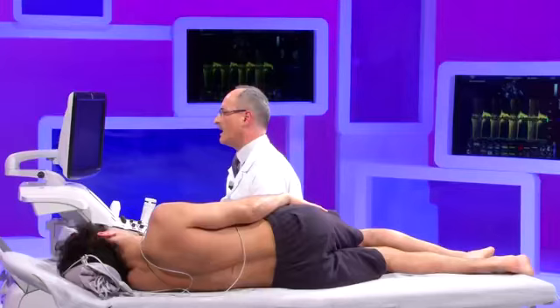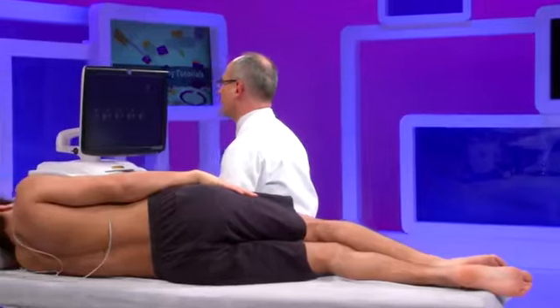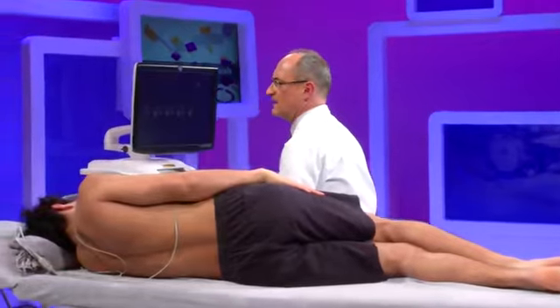Then it may be useful, particularly in patients with heart transplant, if there is anything changed from a previous examination, to look also at the diastolic function of the right ventricle, just sampling the inflow of the right ventricle, as I did now. We have seen that there is a tricuspid regurgitation. There is a pacemaker crossing the tricuspid valve.